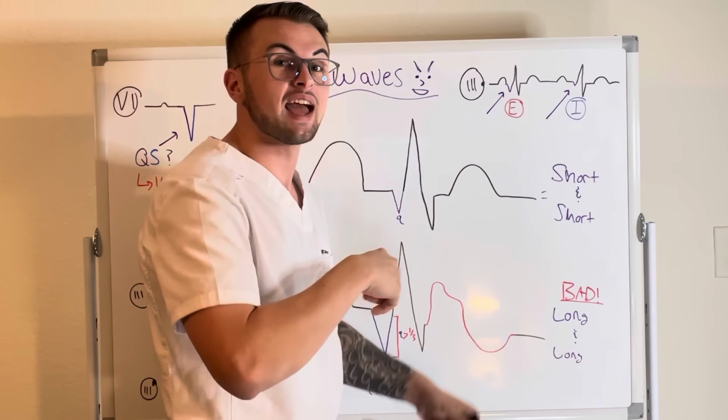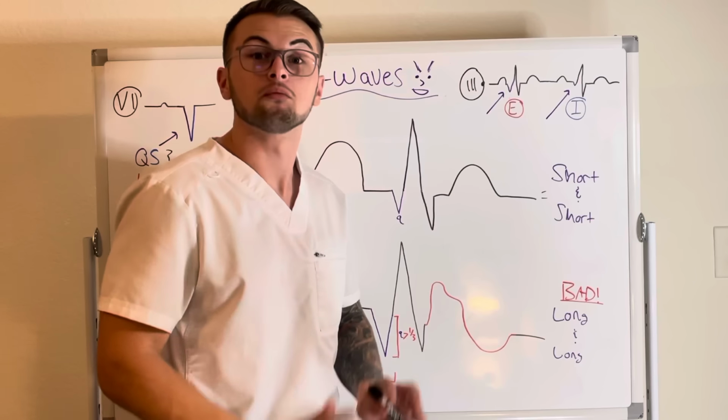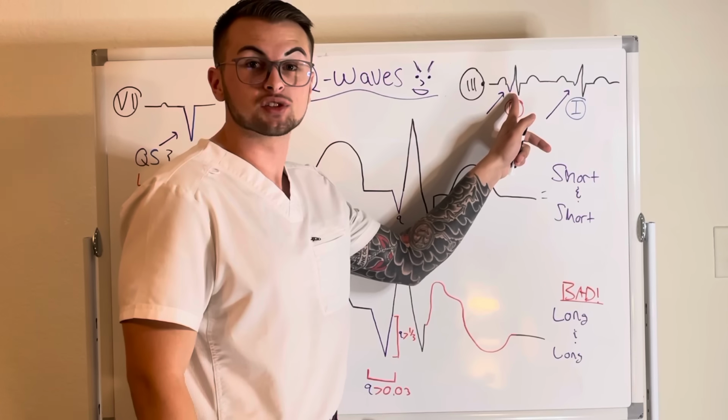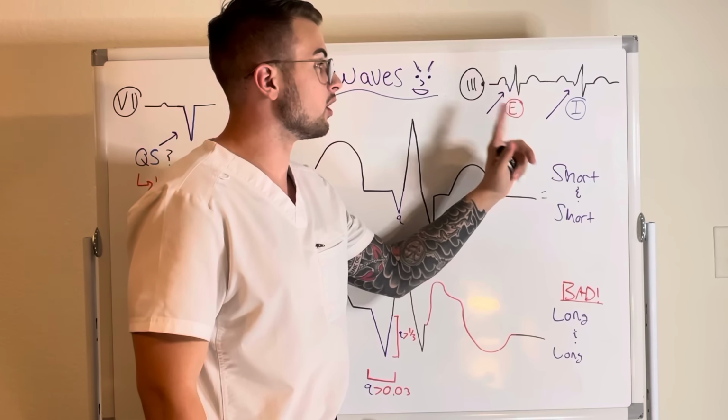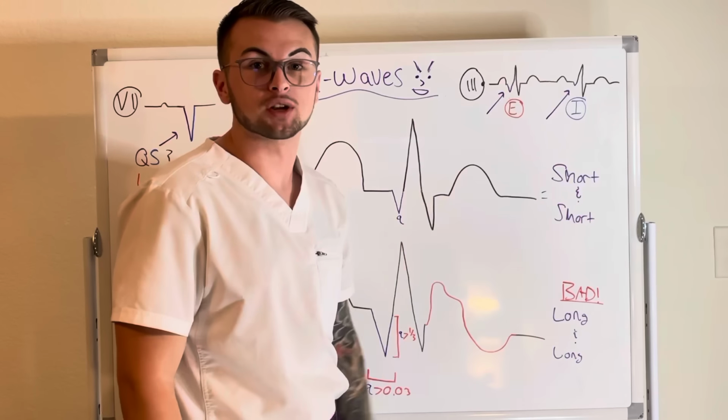If we can see a variance in the Q waves in an EKG, do we panic? No. We can predict that the largest Q waves will be during exhalation, and the smallest Q waves will be during inhalation.